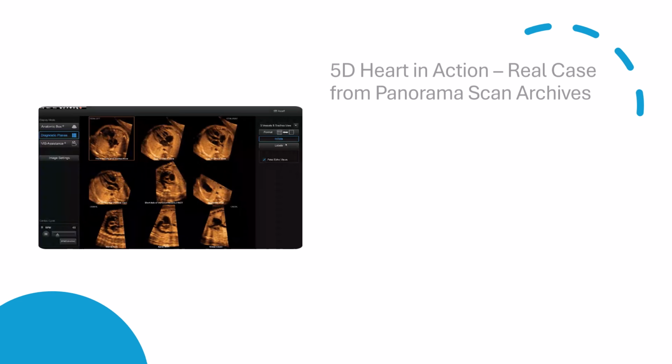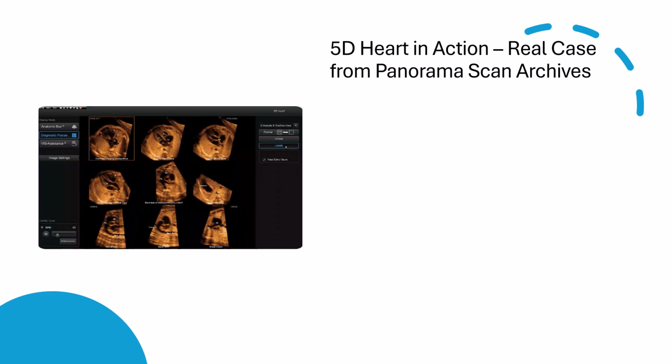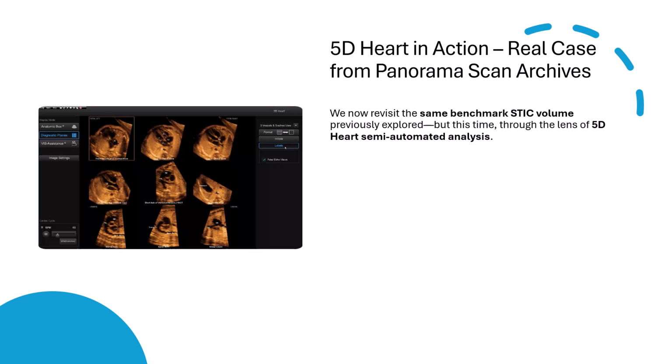Let's bring theory into the real world. What you're seeing here is a real clinical case from Panorama Scan archives, dated back to 2018. It's the same benchmark STIC volume we previously analyzed, but now we are using the 5D Heart automated approach with just a few landmark points identified.